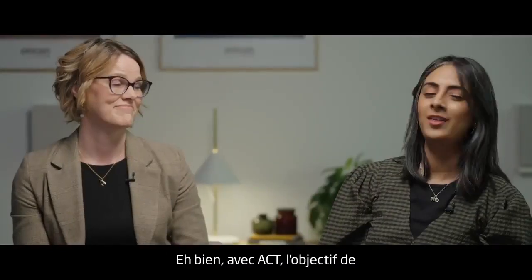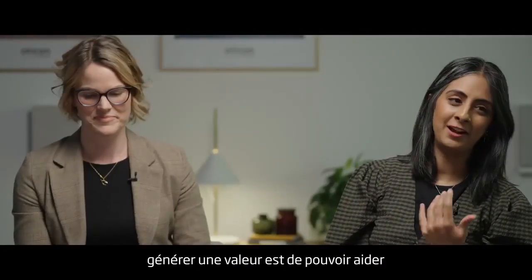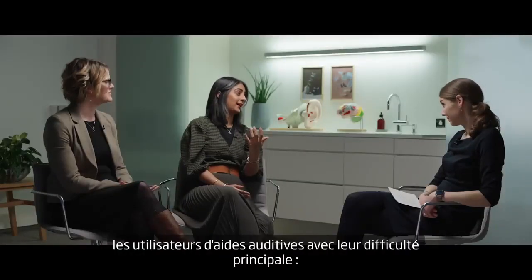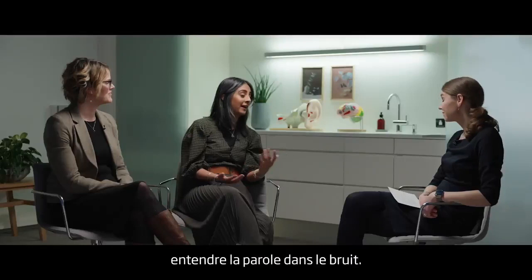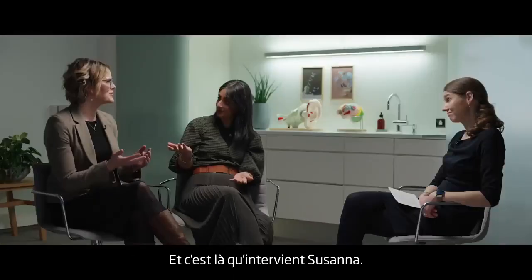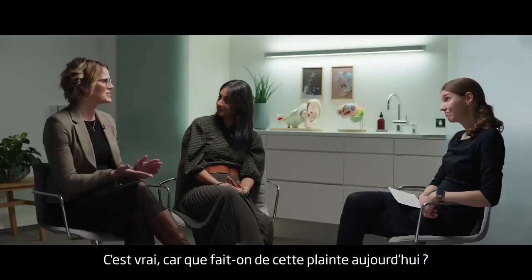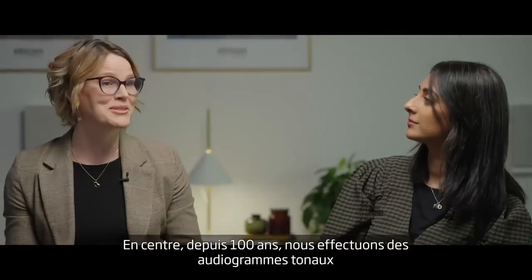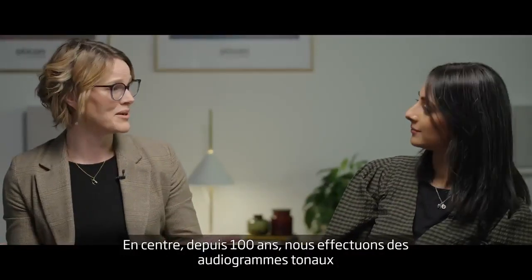Well, with ACT, the whole purpose of generating a value is so that we can help those with hearing aids with their number one complaint, and that is to hear speech in noise. And this is where Susanna comes in. Right, because what do you do with that complaint today? Right, in the clinic, for 100 years, we've been doing a pure tone audiogram.